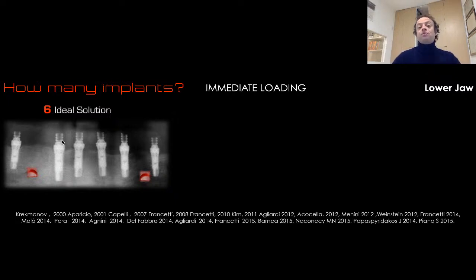It's something that is really rare, unfortunately. It's rare to find patients like this. But of course, when I have a situation like this, the best solution is this kind of approach. All the implants are adequately placed, not adjacent, but with a good distance between each other. And the prosthesis is perfectly balanced from the occlusal and functional point of view.